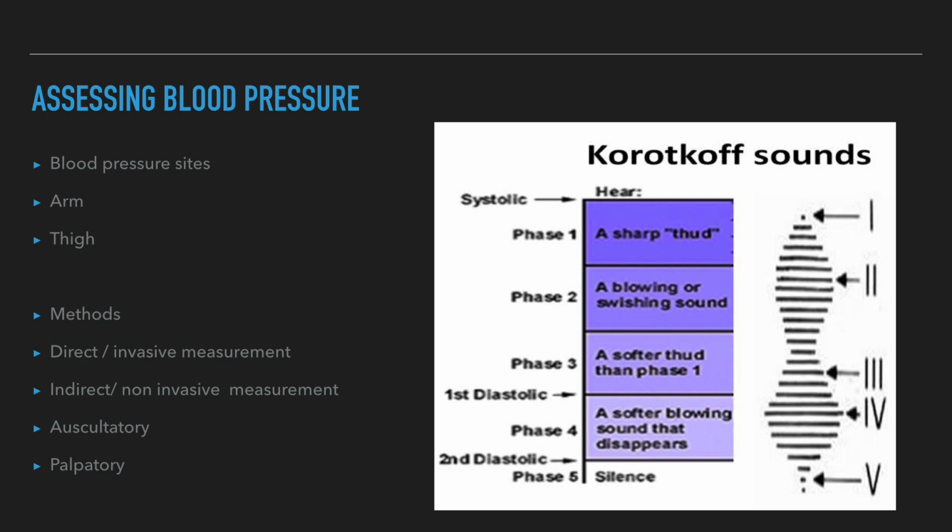Avoid measuring blood pressure in any arm with a venous access device, especially an internal arteriovenous fistula, peripheral vascular access for hemodialysis, or a peripherally inserted central catheter (PICC) line. Also, if the client has had a mastectomy, blood pressure monitoring on the same side can further impede circulation, contributing to lymphedema.